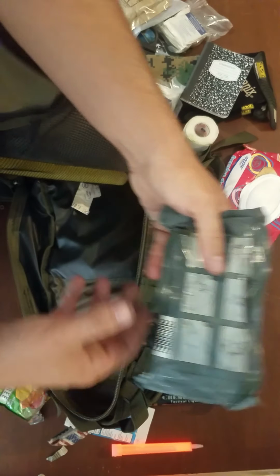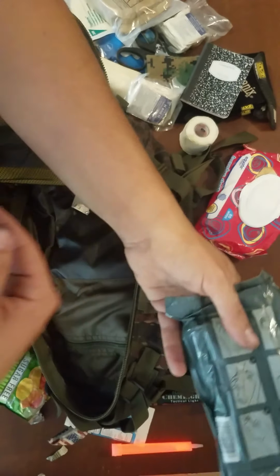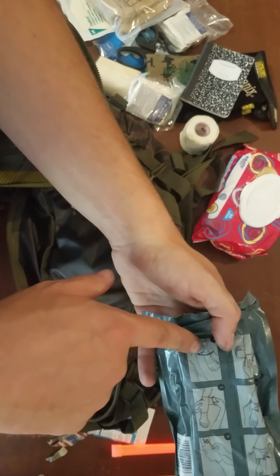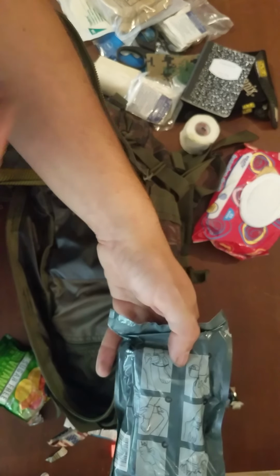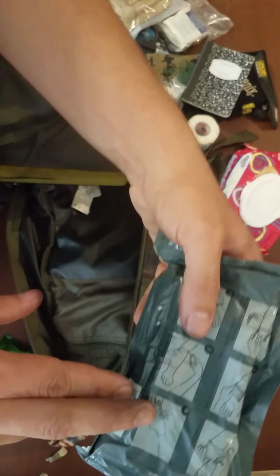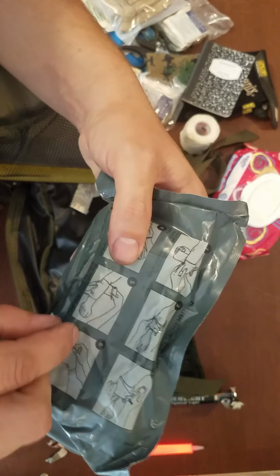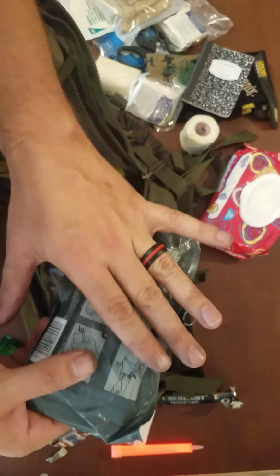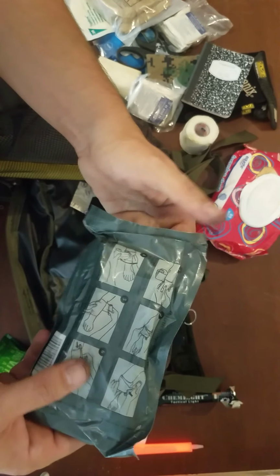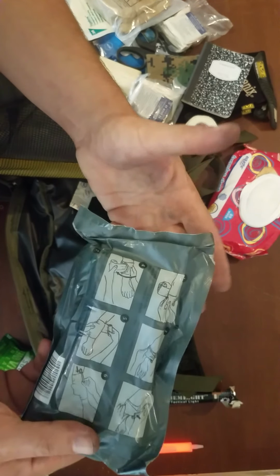And what it is, kind of a bandage like that Ace bandage where you're going to wrap, but it's got a clip in here that at some point you clip it back, and then you go the other way, and it gets really, really tight. And then you kind of finish it off and clip it in. This is an extremely good thing to have. It's probably the best compression you're going to get in the field.